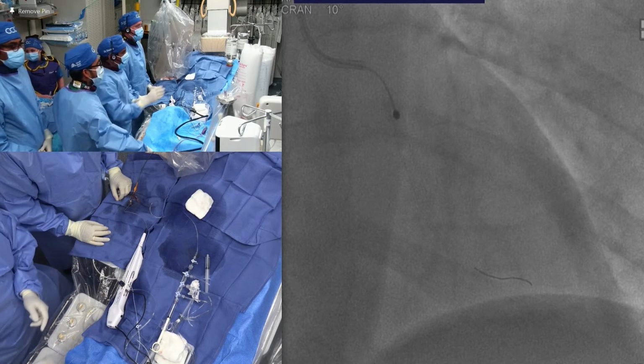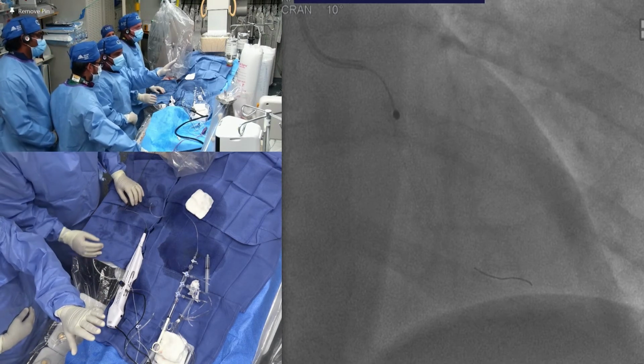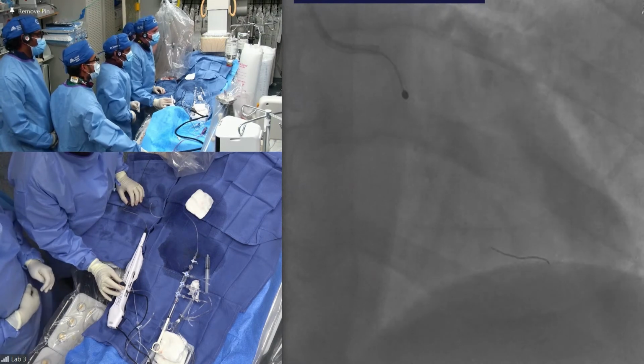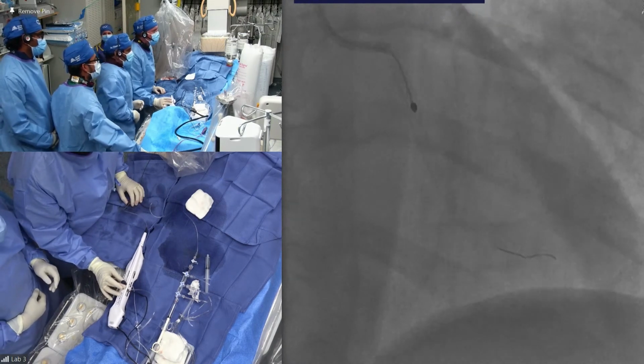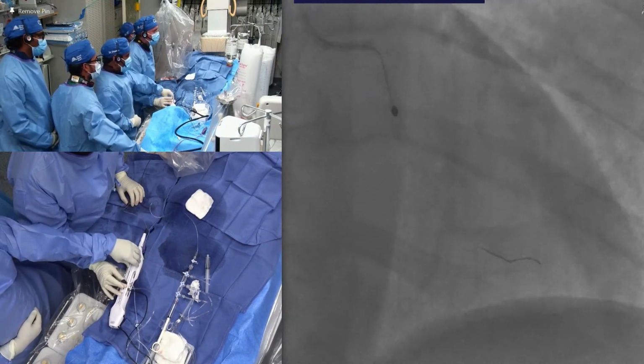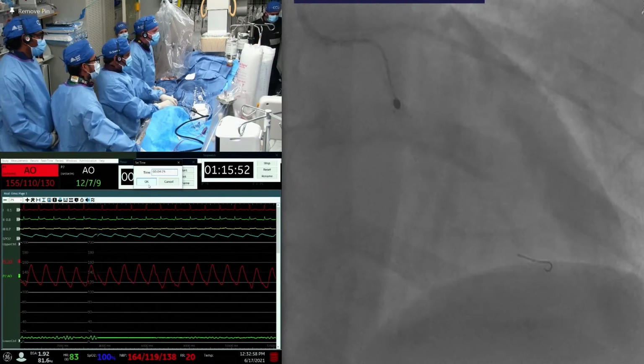Pulse rate is good. We start with a 2.0, maybe a little more aggressive. We'll see for a few seconds, two more runs. If not, we'll downsize to 1.75. I think aminophylline is excellent. We stop using the pacemaker. Oh, you're using an aminophylline infusion. All right, excellent. We stop having perforations of the right ventricle.